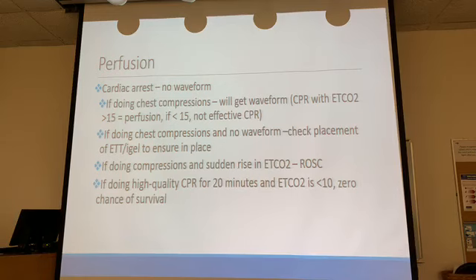Cardiac arrest. You got a patient that's in cardiac arrest, you're not gonna have a waveform. So how do we use end-tidal CO2? Well, first of all, we can use it to determine how well we're doing chest compressions, okay? If you're doing chest compressions, you're gonna have a waveform, first of all. You want an end-tidal CO2 of at least, some people say 10, some people say 15, but if you're doing good chest compressions, you should have at least an end-tidal CO2 of 15, and that's been shown to be an adequate chest compression that's perfusing the patient.